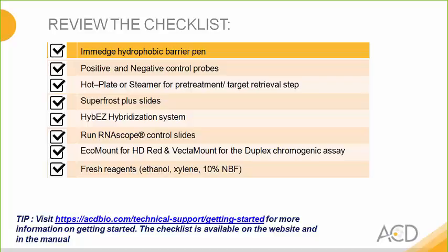And we also highly recommend the use of SuperFrost Plus slides, as with the use of any other slides, we have seen severe tissue detachment. Again, based on the assay that you are running, there are different checklists, and so please review them accordingly.